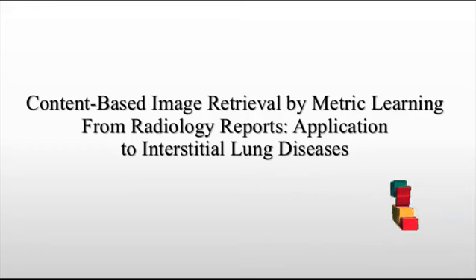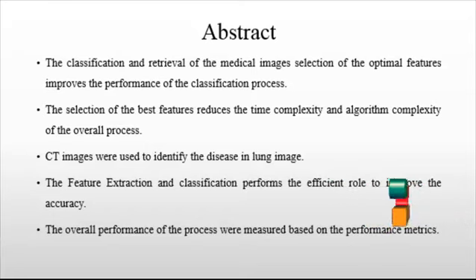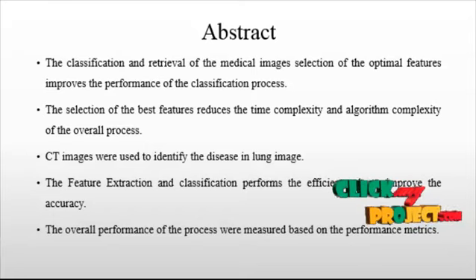Let us discuss content-based image retrieval by metric learning from radiology reports, applications to interstitial lung diseases. Content-based image retrieval is a search technology that aids medical diagnosis by retrieving previously reported cases that are related to the one being diagnosed. So it retrieves the relevant cases.